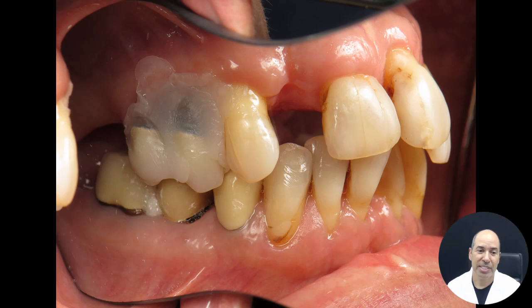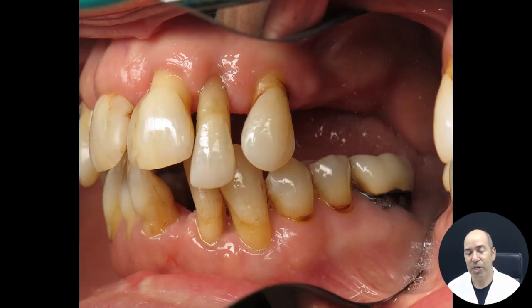When we look at the side view, that thing that looks like wax, she was kind of holding in some teeth that were falling out. So it was like a little Amazon product to just kind of bond something in there. There's cavities. And you can see on the other side as well how there's no real bite. There's no chewing surface besides that removable partial that she was wearing.